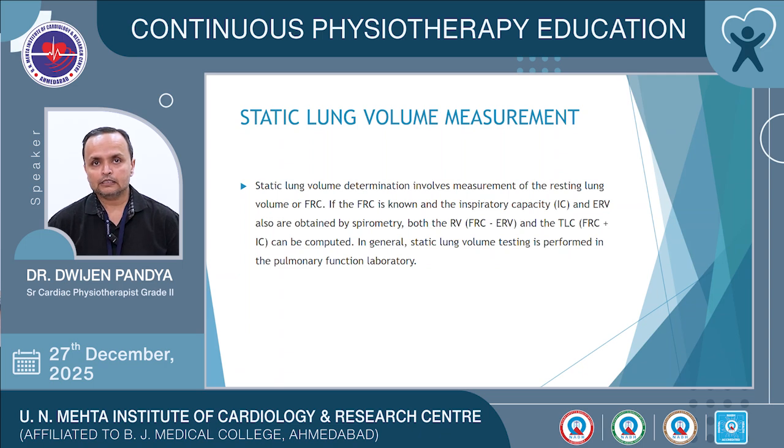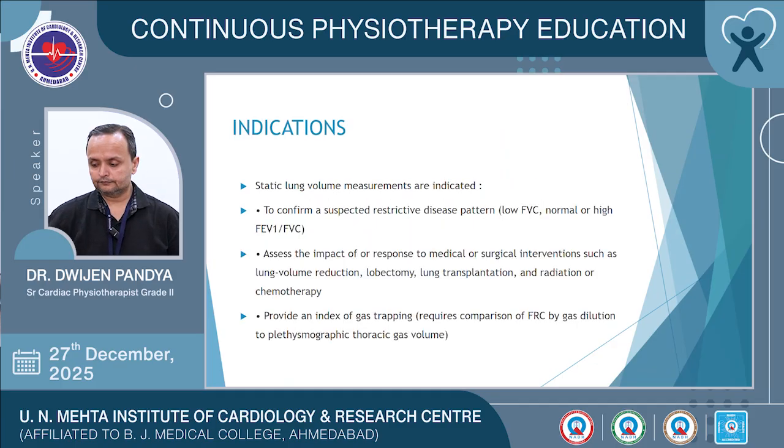If the FRC is known and the inspiratory capacity and expiratory reserve volume also are obtained by spirometry, both the residual volume, that is the FRC minus the expiratory reserve volume, and the total lung capacity, that is the FRC plus IC, can be computed. In general, static lung volume testing is performed in the pulmonary function laboratory.